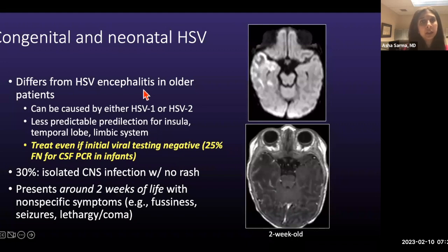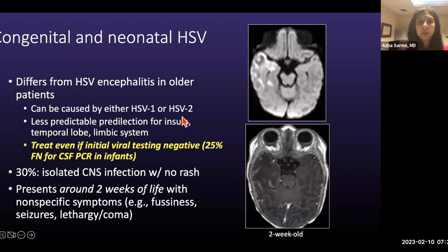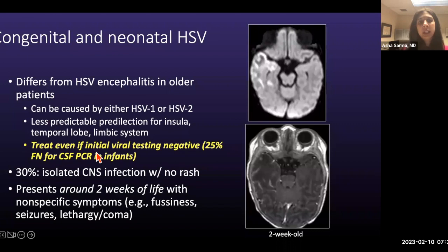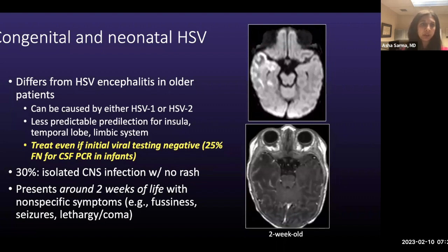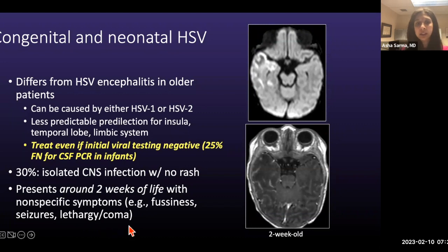Neonatal HSV differs from reactivation disease in several ways: it can be caused by either HSV-1 or HSV-2, whereas reactivation is more associated with HSV-1. There's a less predictable predilection for the insula, temporal lobe, and limbic system. An important teaching point: treat patients if there's clinical suspicion, even if initial viral testing is negative — there's a 25% false-negative rate for CSF PCR in infants, higher than in older patients. You might need to tap a second time. Thirty percent of patients present with isolated CNS infection without a rash. Patients tend to present around two weeks of life with fussiness, seizures, and altered mental status.